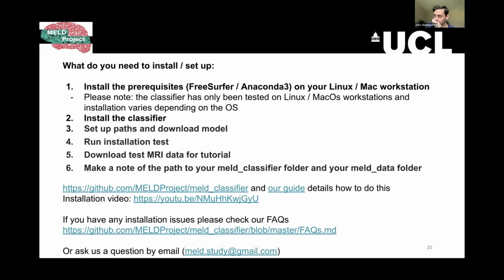Thanks for the question. Just to reiterate, if you start using one version, you should probably stick with it, because otherwise that's essentially a new site, because the FreeSurfer outputs start to look a bit different between versions. So fix the version.